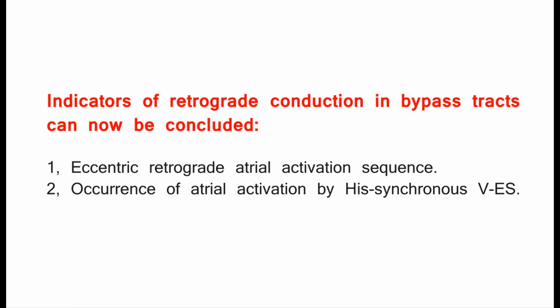Indicators of retrograde conduction in bypass tracts can now be concluded. 1. Eccentric retrograde atrial activation sequence. 2. Occurrence of atrial activation by His-synchronous VES.